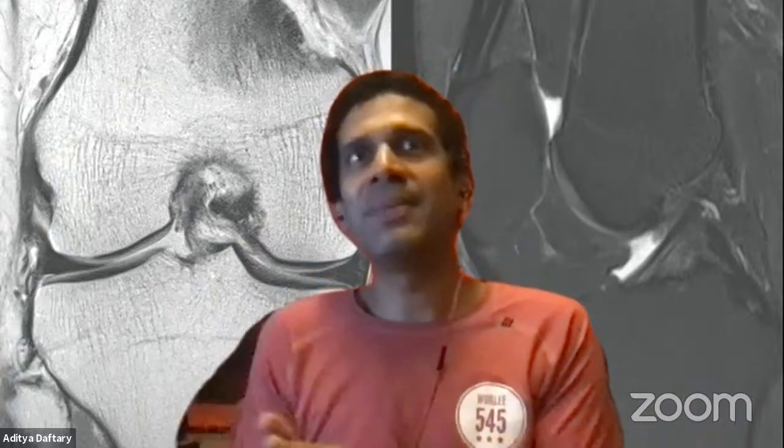The other problem with dynamic MRI usually is that these are done on lower field scanners. So they are 0.2 or 0.5 Tesla scanners. So the resolution of the image that you get is nowhere near as good as you would get on a 1.5 or a 3 Tesla scanner. So, buck for buck, I would take a regular closed scanner way over dynamic MRI in any way, shape, or form.